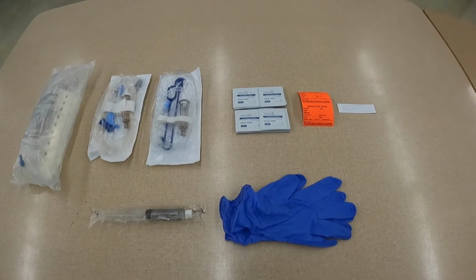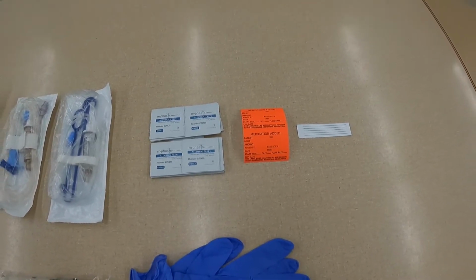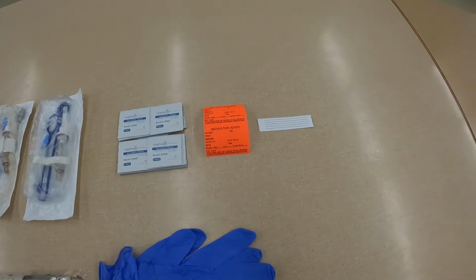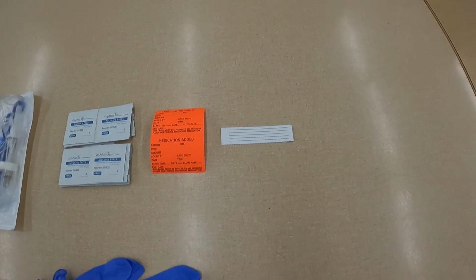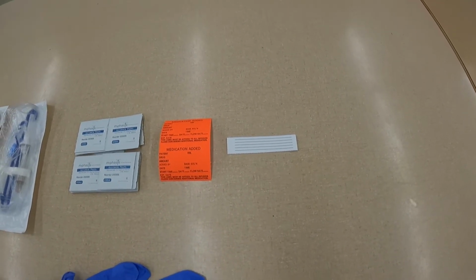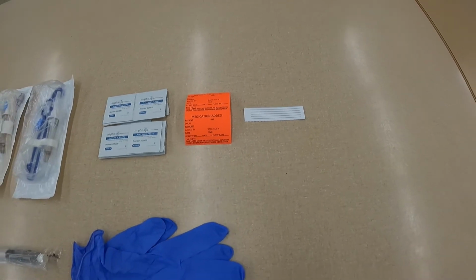Next, we have alcohol swabs, and then we have a label here, which we'll need to fill out with time, date, and our initials, and that is to put on the IV bag so we can identify it. And then we also have a label here, which is what we'll put on the IV tubing itself, and that will just demonstrate, again, the date, the time, who hung it. Therefore, other prior nurses that come in and evaluate the tubing will know per the facility's protocol when it's time to be changing that tubing.